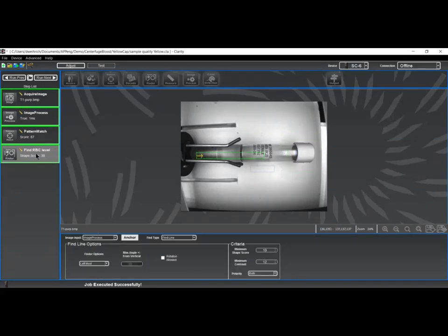I've now added a process to find the liquid level that is the interface between the red blood cells and the serum. This region of interest here was sized in order to cover the extent of what is likely to be the red blood cell interface. It's not necessarily the whole tube, because the red blood cells should never fill the whole tube. This process is anchored to the pattern match process that was previously executed.